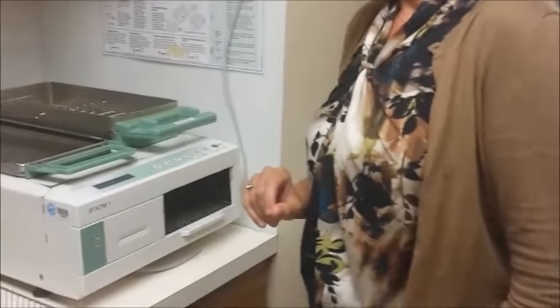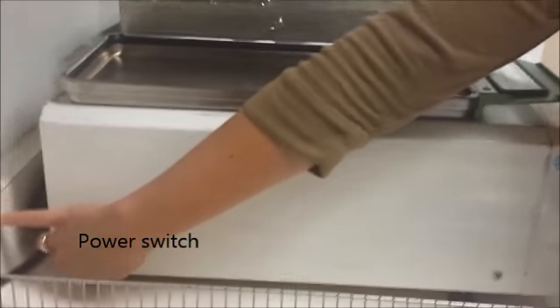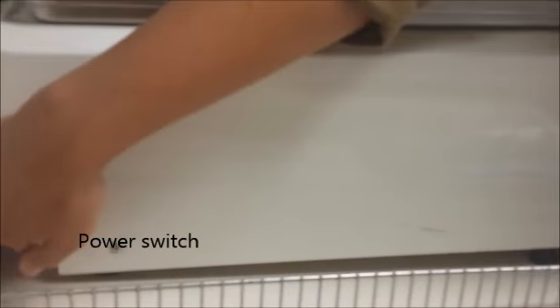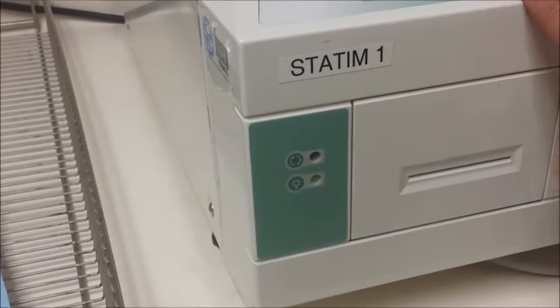The power switch for the Statim is on the rear of the machine, way down toward the bottom — it's just a little flip switch. You will know it's on because there is a green light on the front of the Statim that will illuminate green, and your LCD display will also have some words on it.